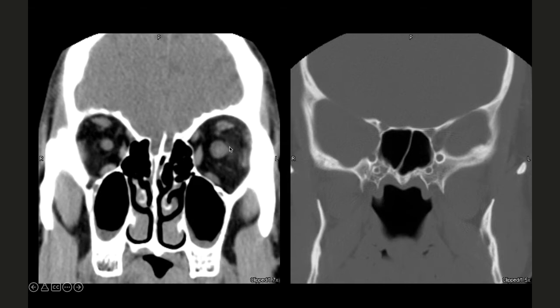So that's why I always keep looking at your normals, because once you know your normal, then it's easy to pick the abnormal. And if I didn't know, now I'm going to say there is a little bit of fat stranding and stuff, so this must be abnormal. However, for the purpose of anatomy, this would be your optic nerve.